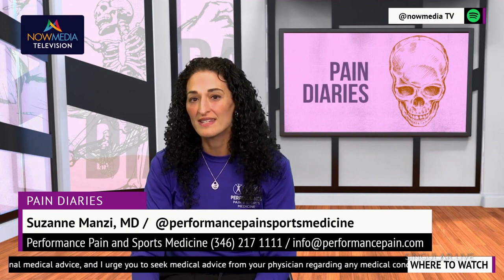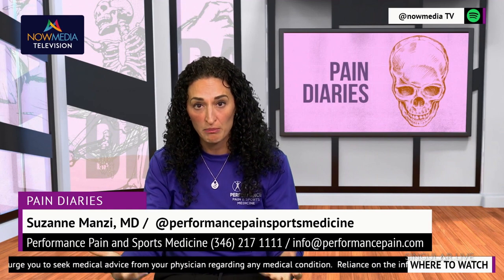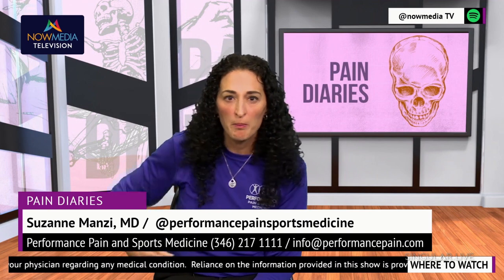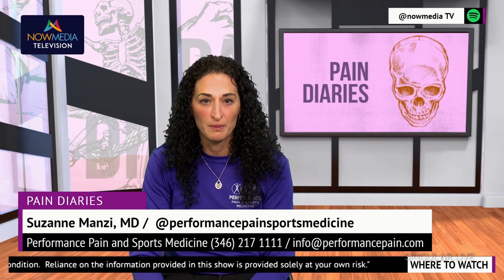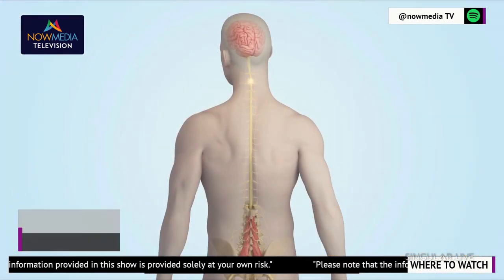So where is this IPG, implantable pulse generator, or the battery, placed? So the IPG, which also contains the battery pack, is generally implanted in the upper part of the buttock, below the belt line and above the seat line, or in the flank between the hips and the ribs to make it as comfortable as possible. It's tailored to every individual patient.